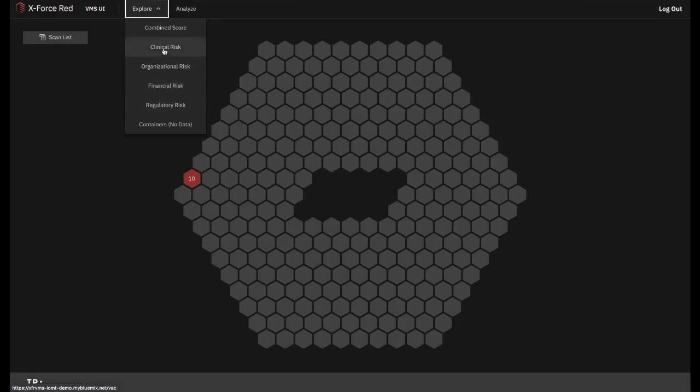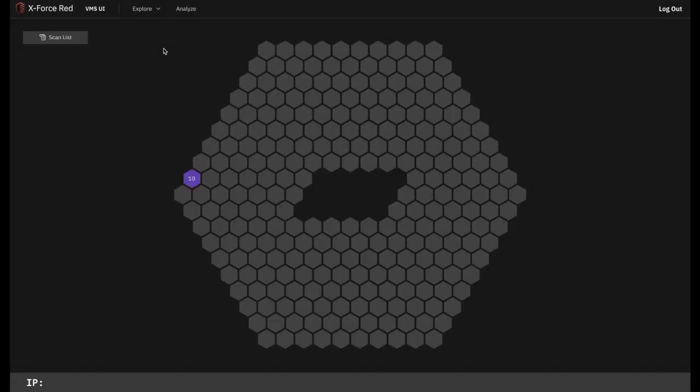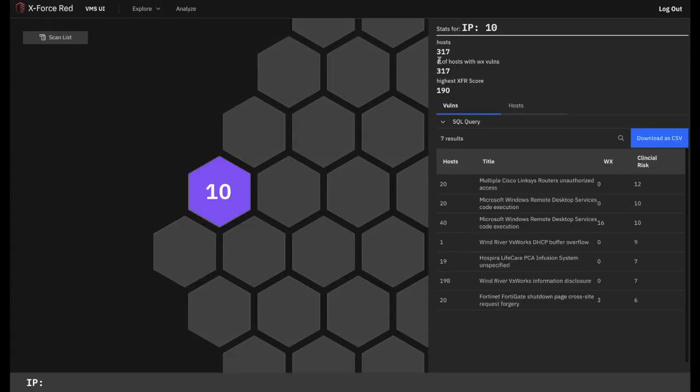Since I'm a clinician, let's continue this demo using the clinical view. You now see that the honeycomb heat map will use shades of purple to prioritize vulnerabilities. Let's navigate deeper into this network.